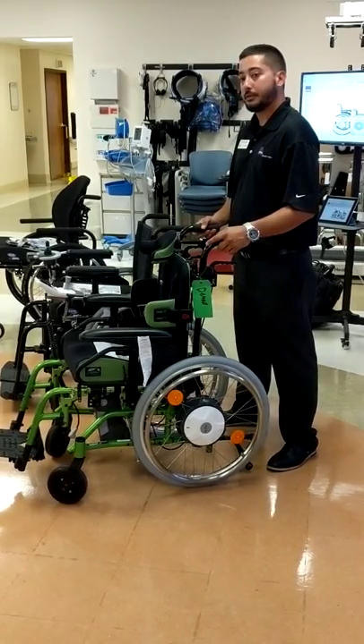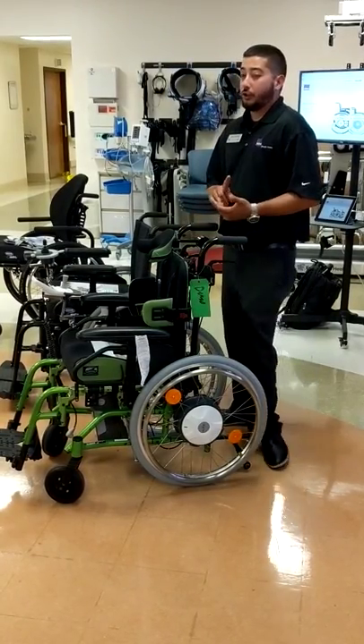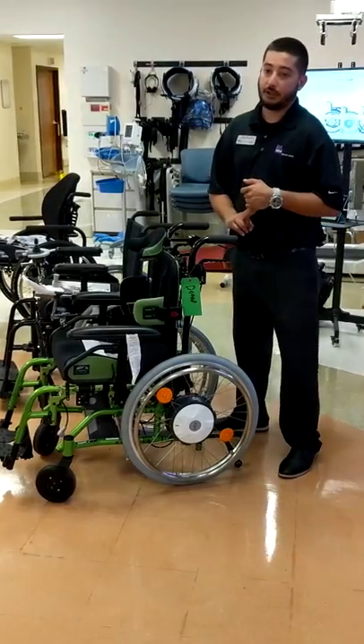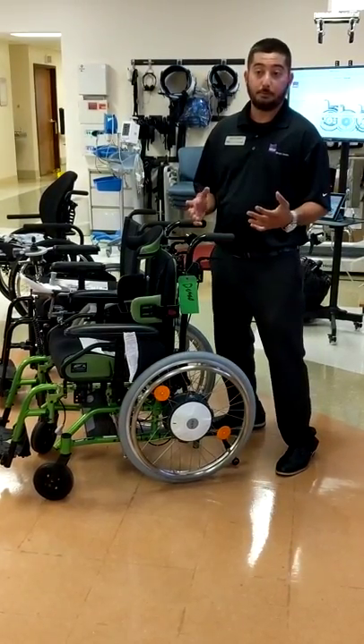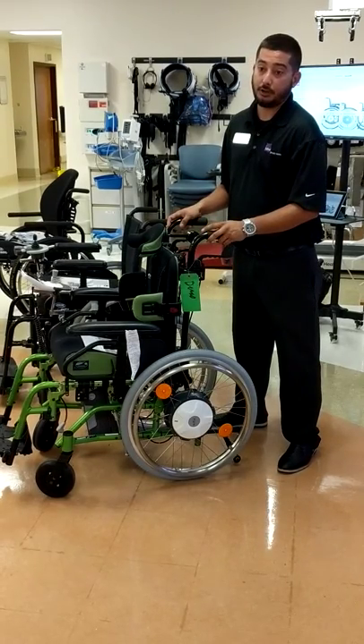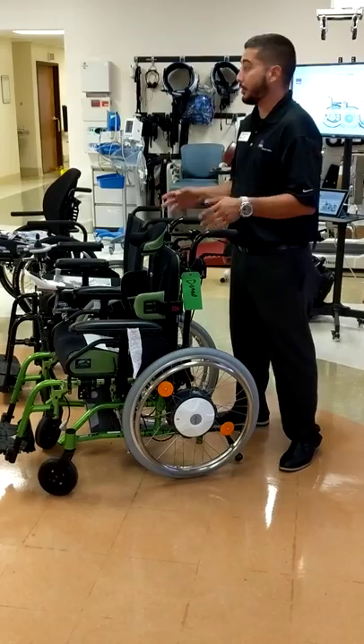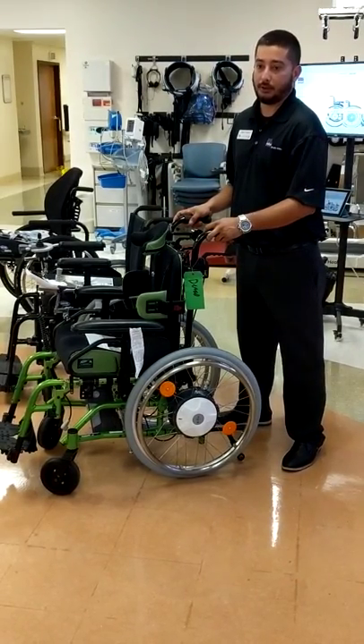Could you push a bariatric chair on one of these wheels? We have 22 and 24-inch wheels — we don't have a 26-inch wheel — but we can accommodate up to a 352-pound end user. So for most bariatrics, if it gets any bigger than 350 pounds, unfortunately that's our limit.